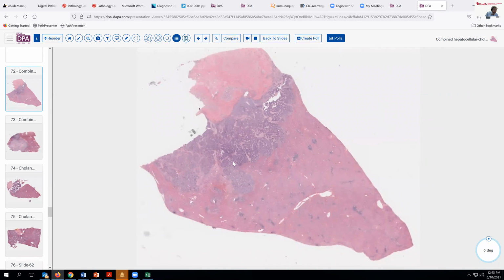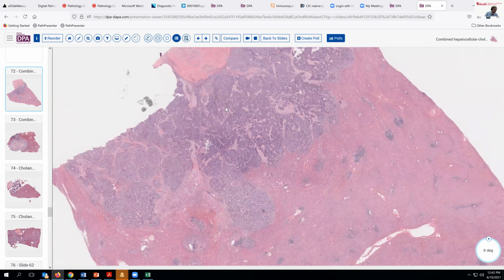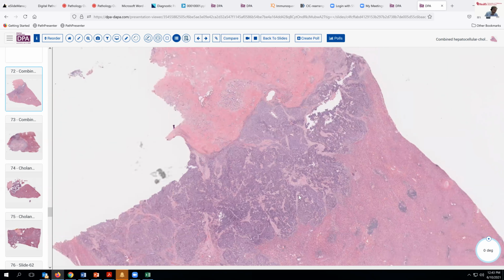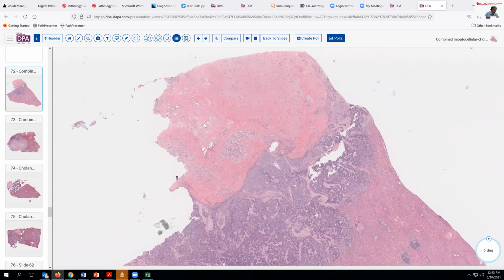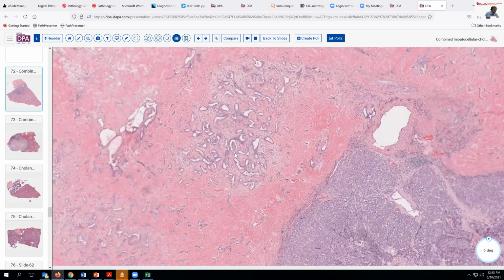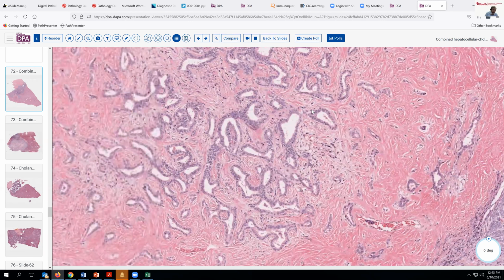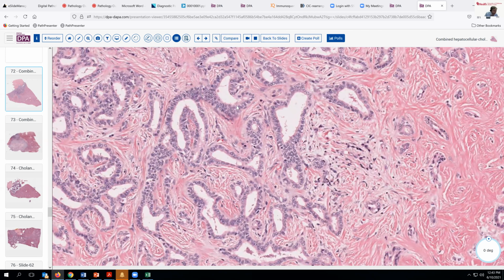So this is a nice example that illustrates the tumor with both of these morphologies. As we look at this, we see, well, here we have some solid tumor here, and then right next to it here, we have this very sclerotic pattern with small glands that looks like cholangiocarcinoma, not high-grade malignancy, but clearly malignant glands, high NC ratio, crowding, and so forth with this sclerotic background.